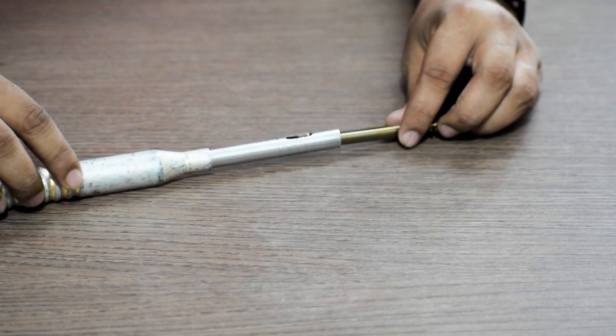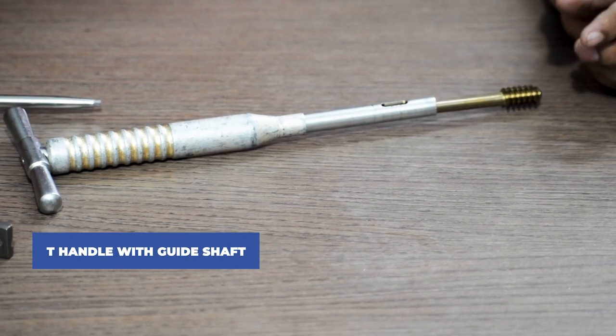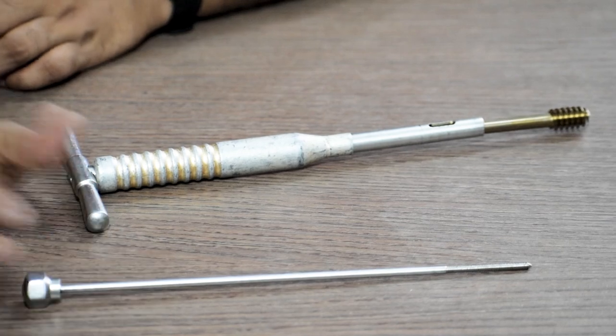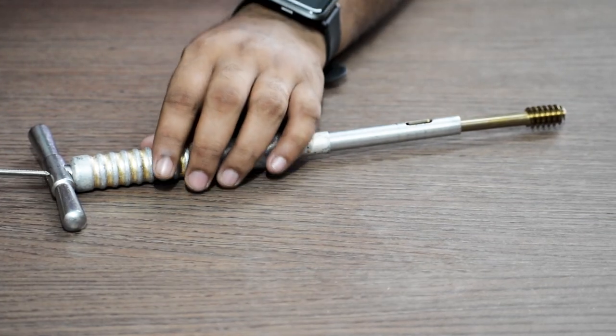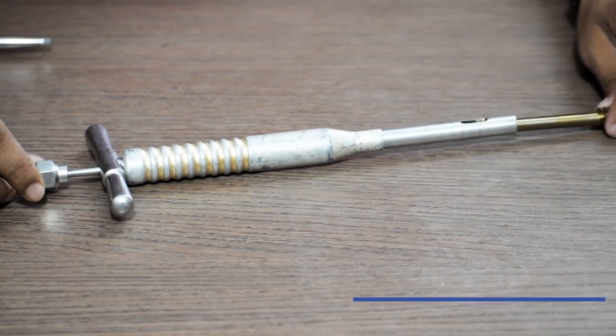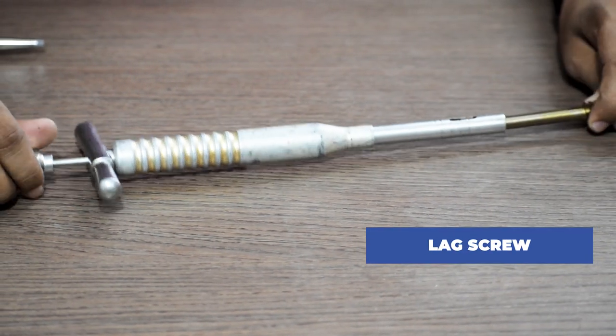After that we attach the T-handle and then insert the guide shaft through the T-handle. Lock the lag screw with the guide shaft.